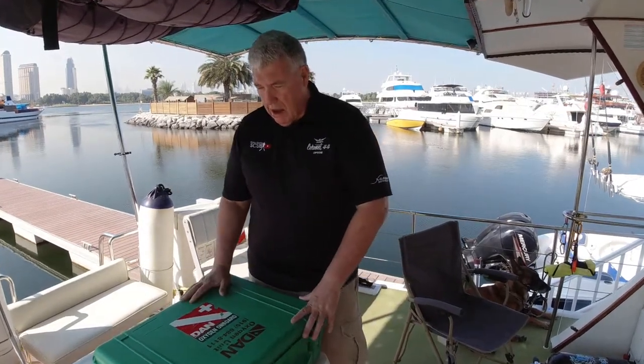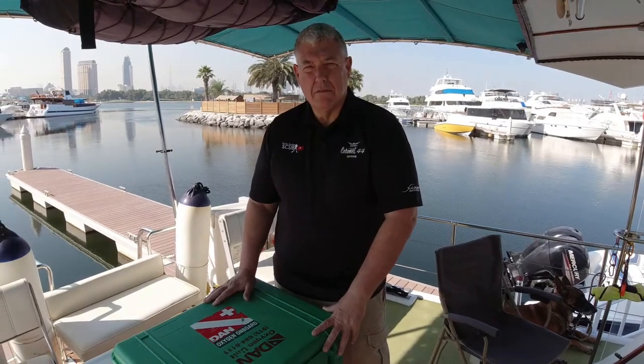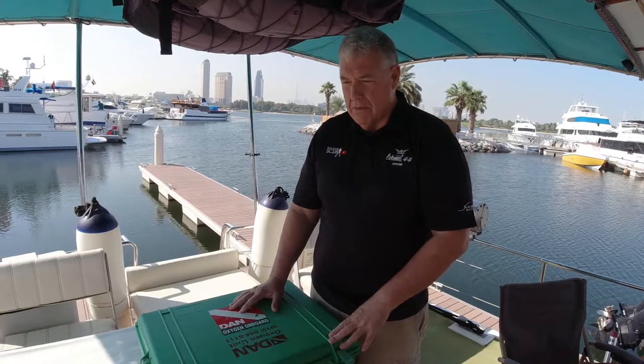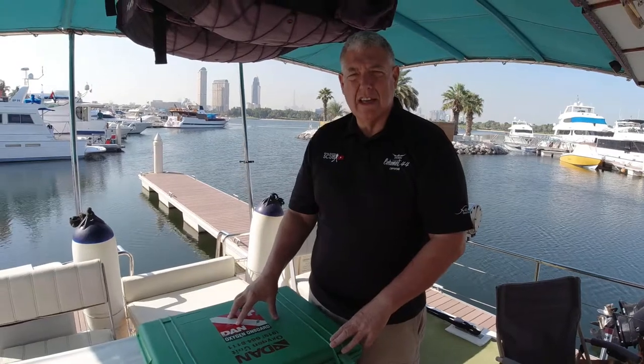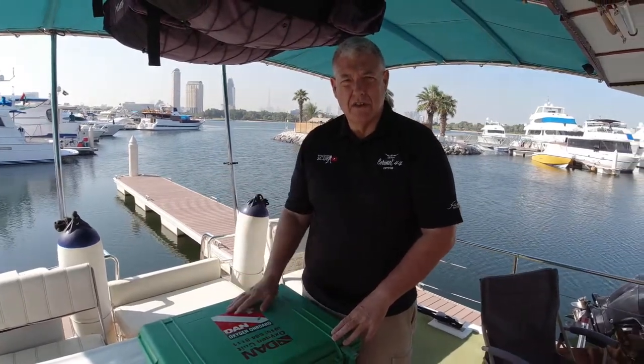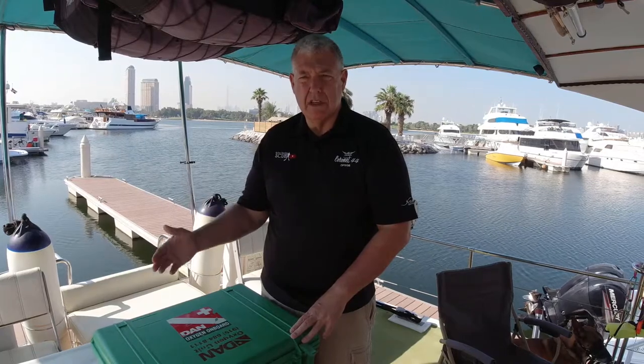I've just been given this kit by an instructor that's just retiring. It's quite an old kit. He says he's never used it except for some rescue training and says it should be like new. I'll be really surprised if it is. Just before we open the box, I'll talk about DAN, which means Divers Alert Network. They were originally founded in the States as a not-for-profit organization dedicated to researching diving illnesses and the effects of pressure underwater.